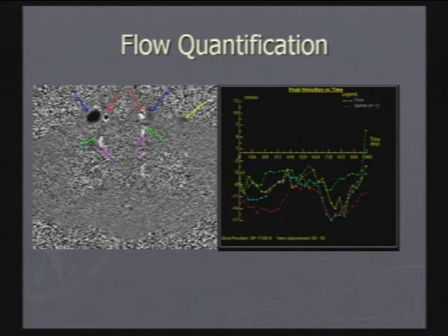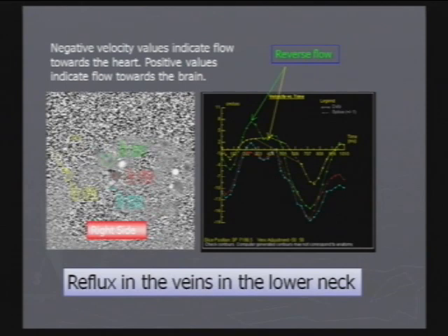So what I need to tell you is each of the little dots in these plots here represents about 50 milliseconds in the cardiac cycle. So we collect the data roughly 20 times per second so that we can map out the flow from diastole to systole and again throughout the cardiac cycle. So what does it look like when we have somebody with multiple sclerosis?